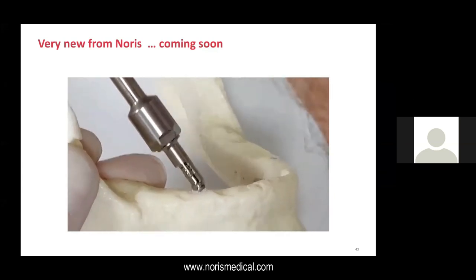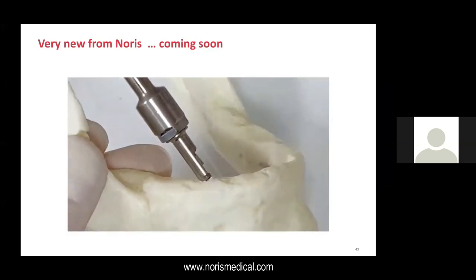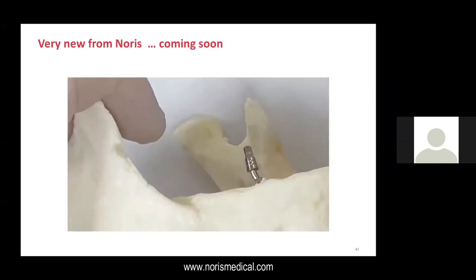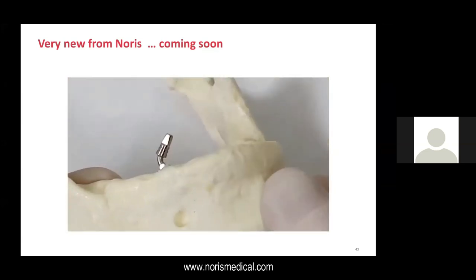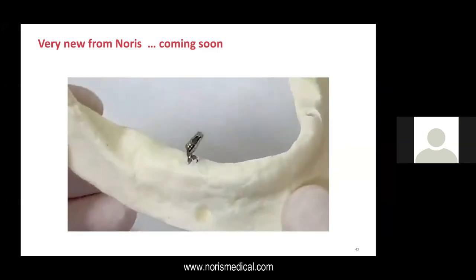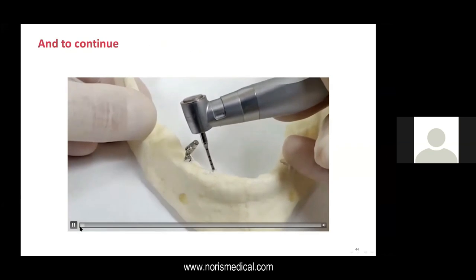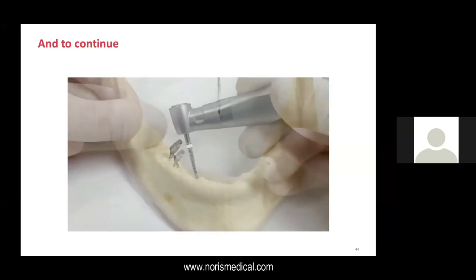As you can see, this implant goes deep in a very, very strange angle. And here you can see how very easily this implant is actually bent to the right place. Now, for those of you who want to know where should the neck be, of course, the neck should be below the gingival line. So this is very important. Here we continue. We are adding another implant just to show you.